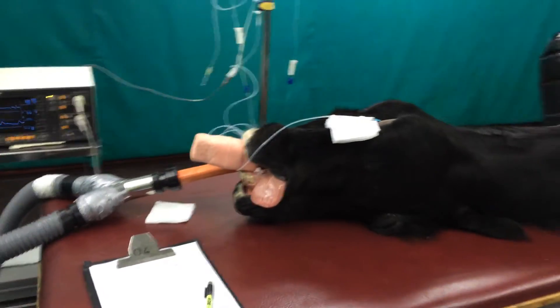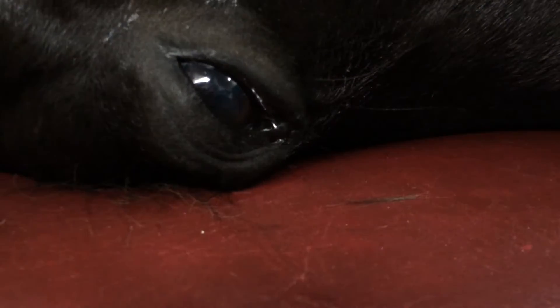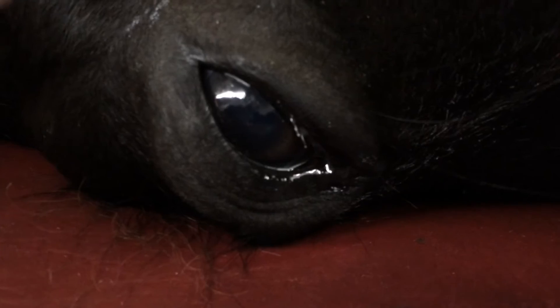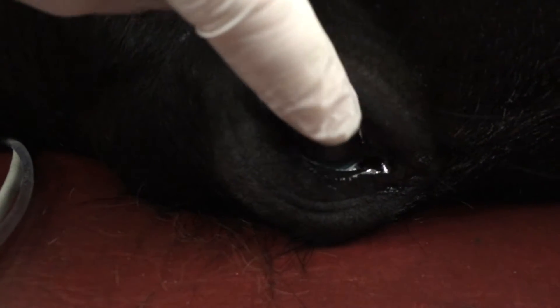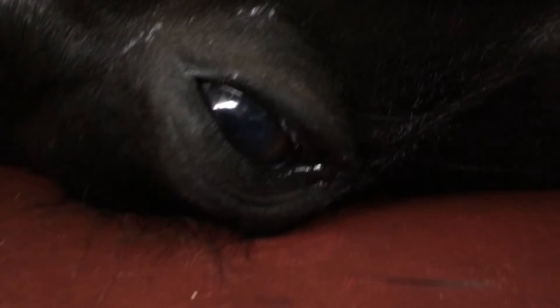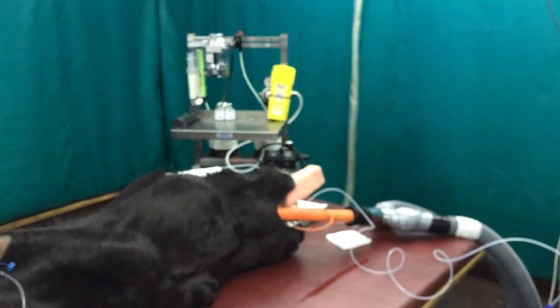Now I said I'd show you the other eye, so if I just go around to the other side here — I'll show you the horse's left eye and you'll notice that rather than rolled downwards and inwards, this eye has a central position, and that's quite normal. If we just check the palpebral reflex we can see there's a slow blink, and also you may have seen that tear drop — there's a nice lacrimation. That's a good plane of anaesthesia: one eye rolled downwards and one eye central.